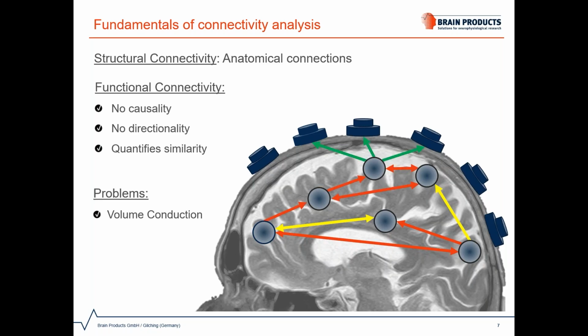I will get back to this subject in more detail, but the general problem is that we often measure the signal of one oscillating source at many different sensors. Such spurious correlations interfere with our analysis and distort the picture of real connectivity that we want to investigate. We will learn about steps in our analysis, how to mitigate these effects and avoid making false interpretations.